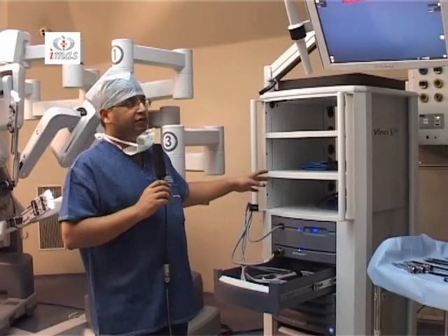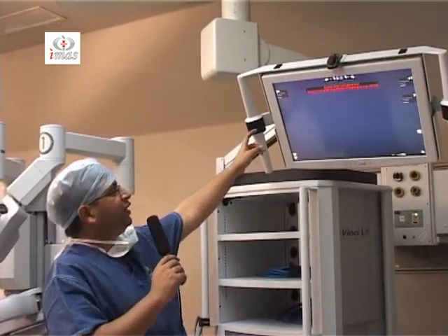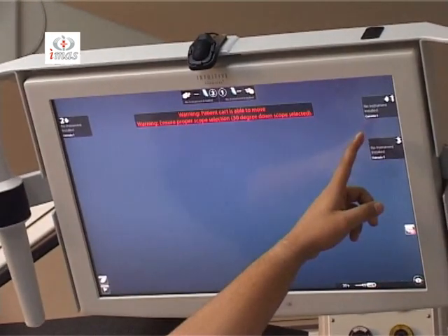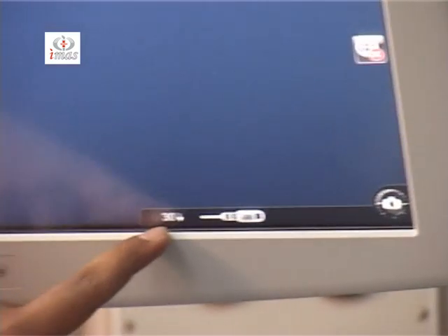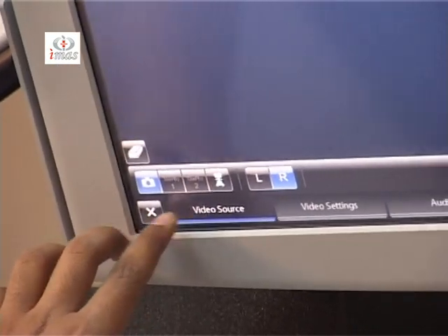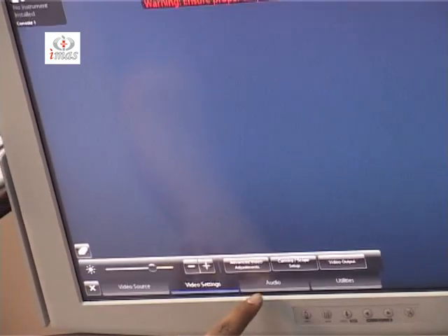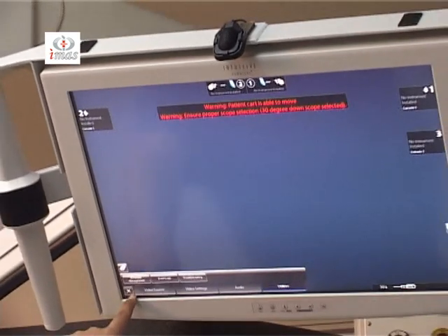This is the vision cart, which contains the 24 inch LCD screen, which displays all the controls, the instrument arms, the instruments installed on each arm, the camera position, its rotation, the scope direction, 0 degree or 30 degree down or 30 degree up, and there are various adjustments you can do. This is a touch screen, you just touch, you can use the video source, video settings, audio settings and utilities, and you can see troubleshooting and event logs, and you can see the inventory management.